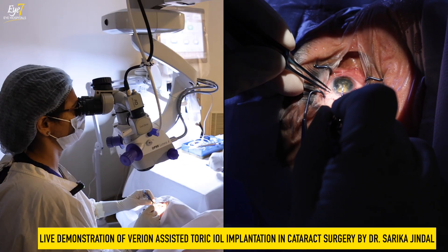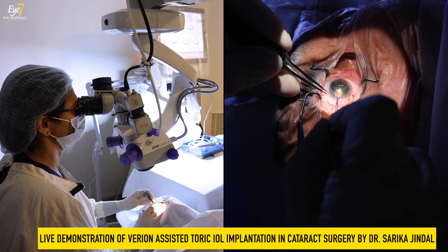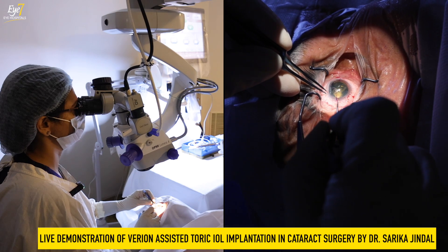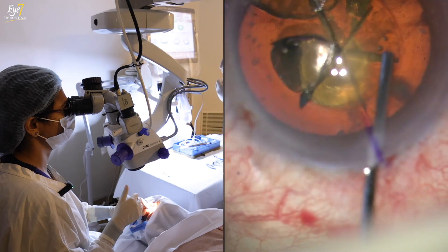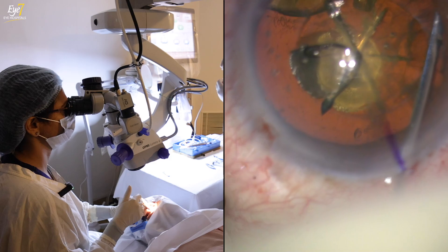Now we are taking out the separated capsulotomy part. Now I am doing hydro dissection.